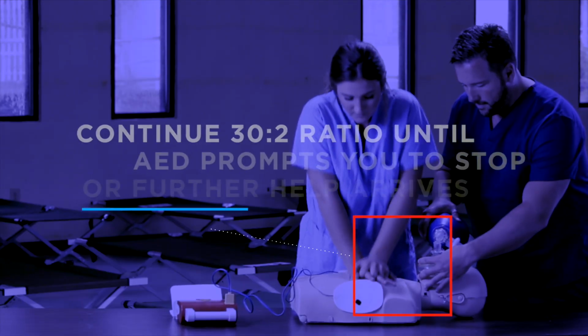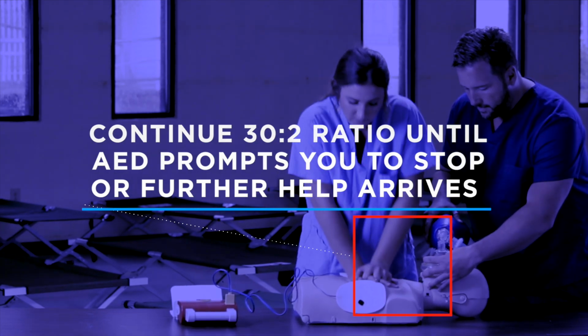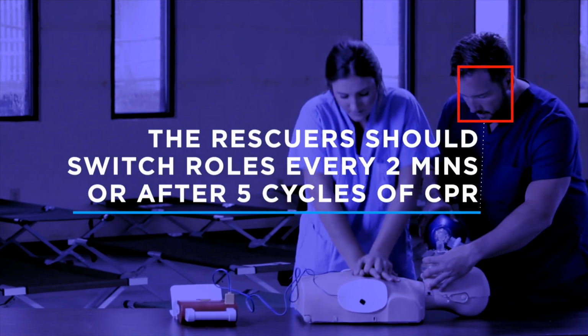Continue CPR at this ratio of 30 compressions to 2 breaths until the AED prompts you to stop or further help arrives. The rescuer should switch roles every 2 minutes or after 5 cycles of CPR.